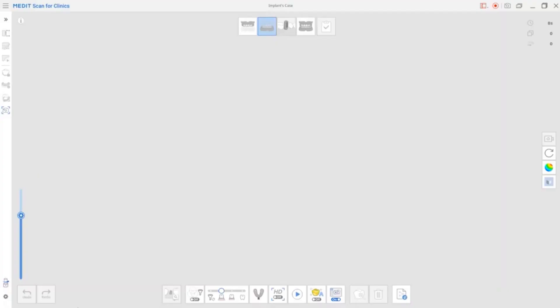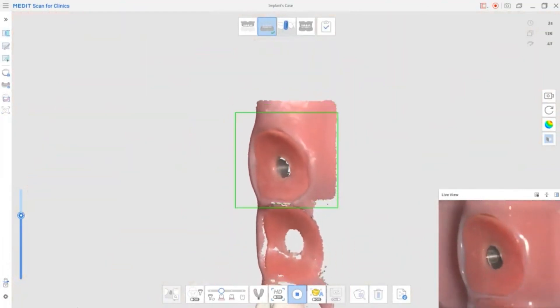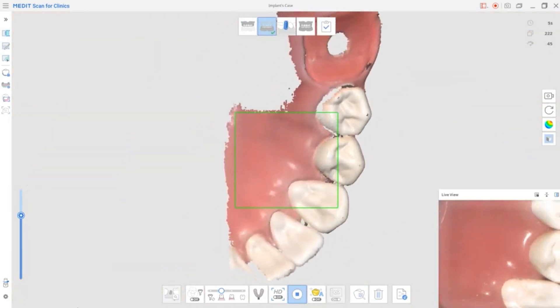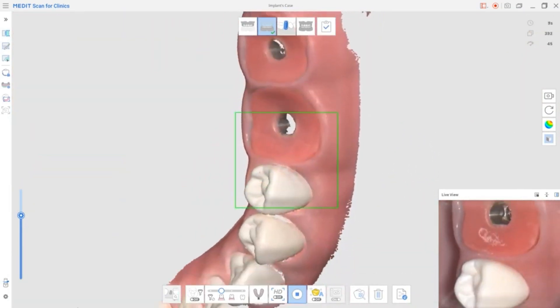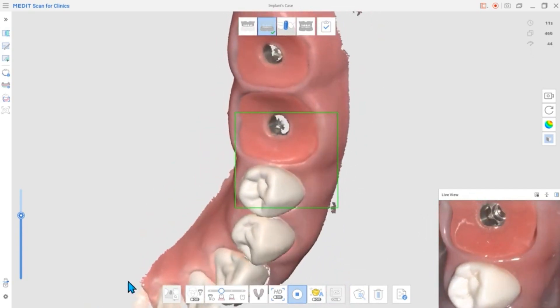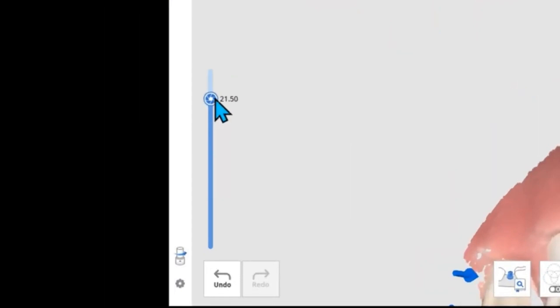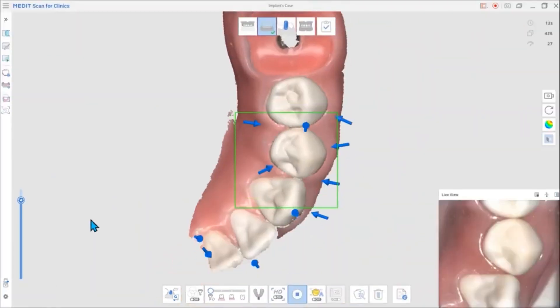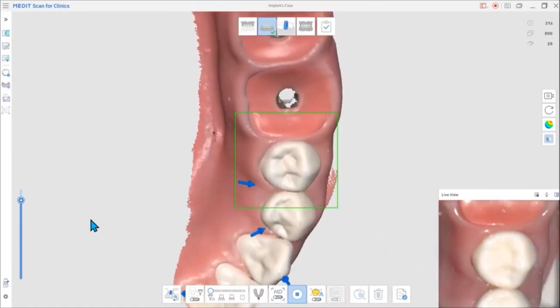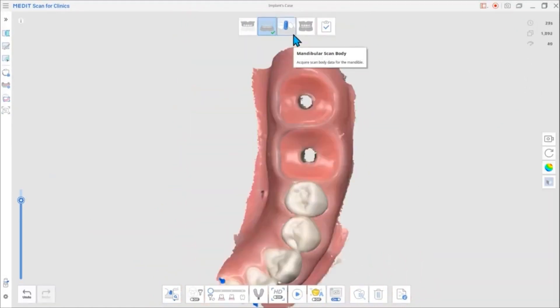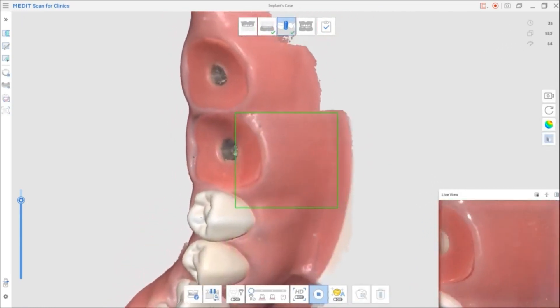Now that we've gone over the library, we'll explain in greater detail how to use this feature. First, scan the implant area's arch. Begin scanning the adjacent teeth and thoroughly scan the emergence profile. You can set the scan depth to be high so you can scan deeper. When the arch scan is ready, go to the Scan Body stage. Fasten the scan body and obtain additional scan data.